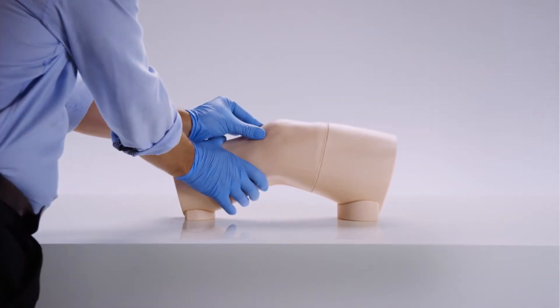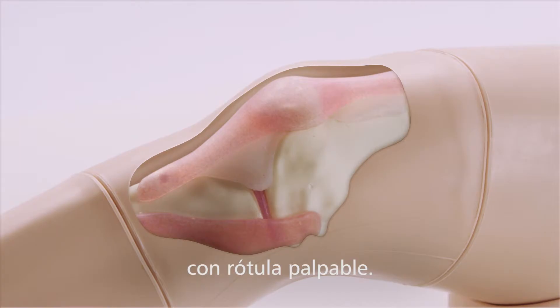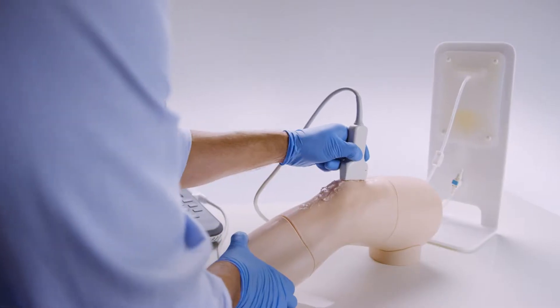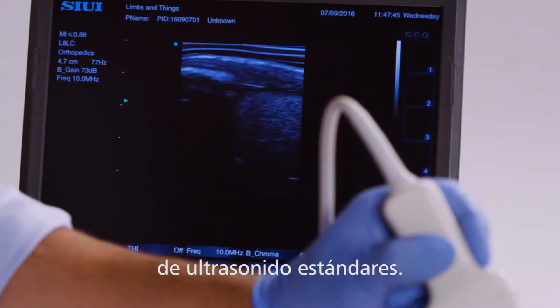Beneath the skin lies accurate internal anatomy and palpable patella. The proprietary echolucent material allows the knee to be used with all standard ultrasound machines.